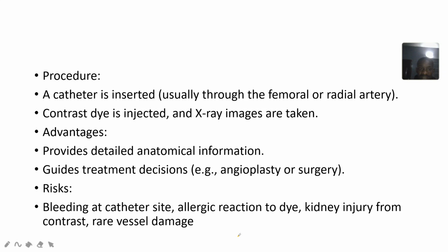For the procedure, a catheter is inserted through the femoral or radial artery, and they inject the contrast dye there. Then when they take X-rays, the place should be much clearer. The blood vessels should be much clearer. This provides detailed anatomical information, so from there you can know which type of treatment to administer to such a patient.